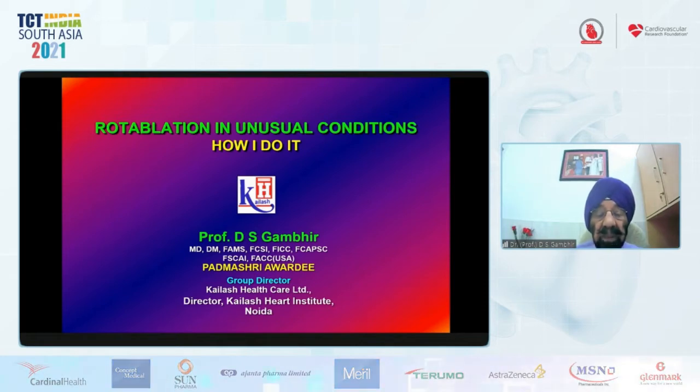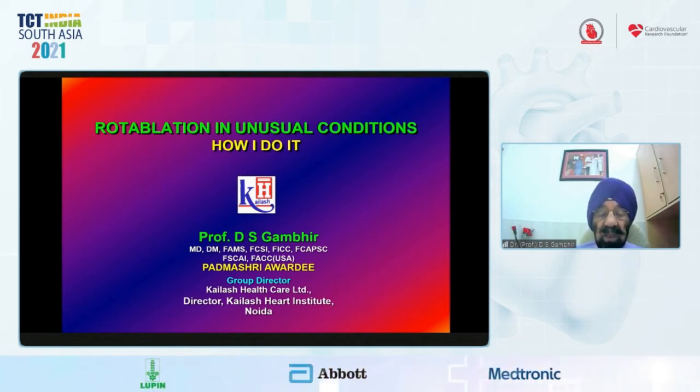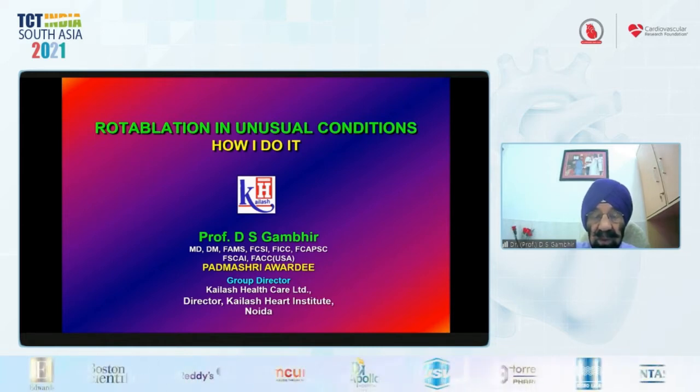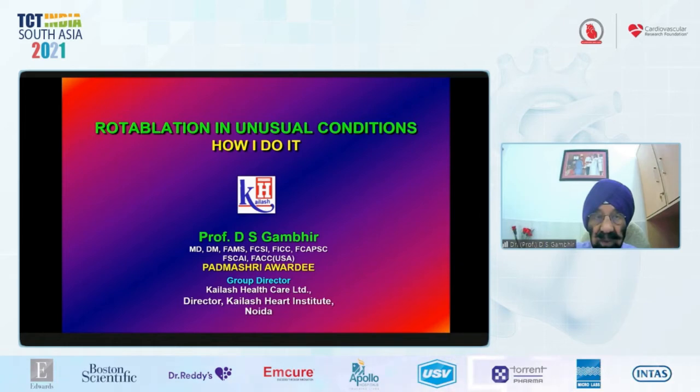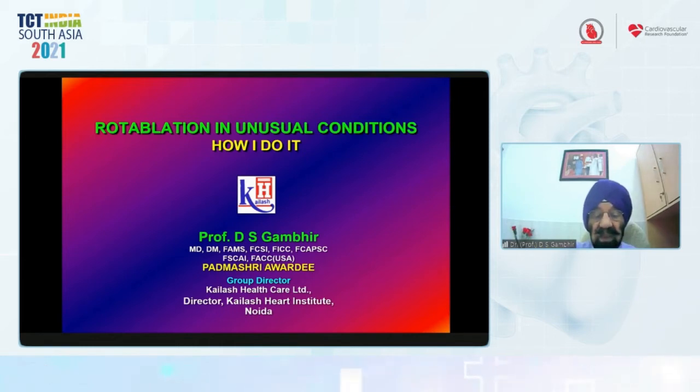I'm going to speak about rotablation in unusual conditions, because in the usual conditions, I'm sure everybody who does rota knows how to do it. As you know, rota has now become established over the past 3 decades as one of the modalities in the treatment of coronary artery disease, particularly fibrotic and highly calcific stenotic lesions, which are not dilatable or crossable with a balloon, and the results of stenting in such situations are suboptimal.